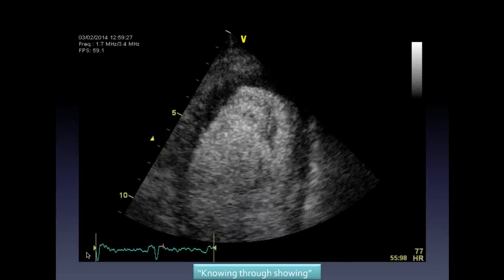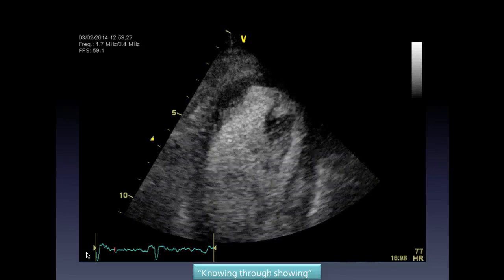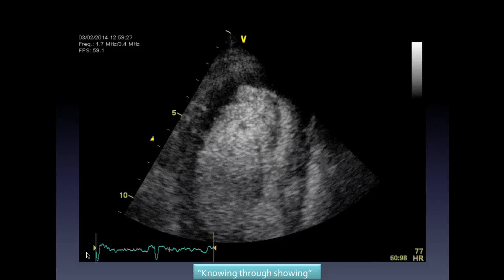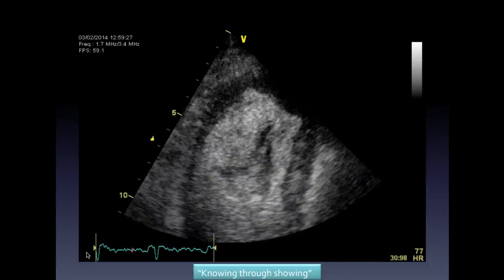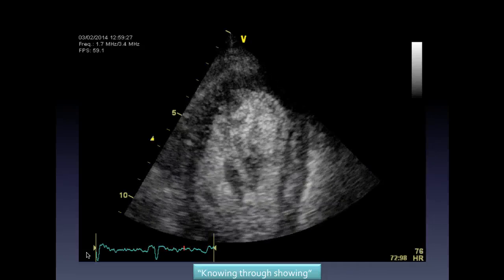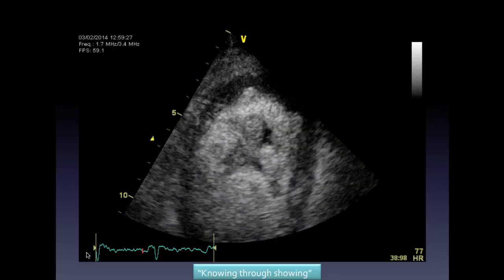Okay? But there is this regional wall motion abnormality, which is quite dramatic, which shows dyskinesis. I hate to tell you, I did that from the ECG, by the way, the gallop rhythm and the heart failure. So, just confirming what you saw in the ECG, but massive dyskinesia, very low flow. You don't need to measure the cardiac output to know that the cardiac output is going to be low here. But luckily, I don't think it is free wall rupture. Okay, so the contrast, I can't mention it again, the contrast saved the day there.